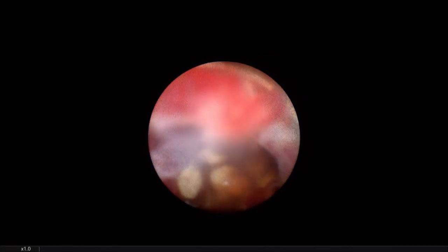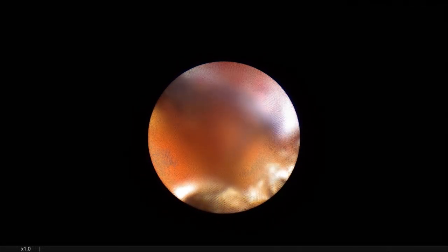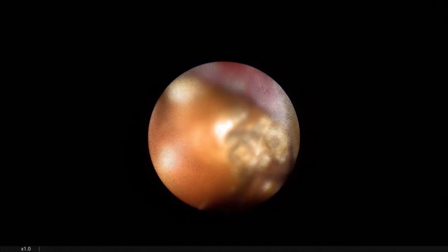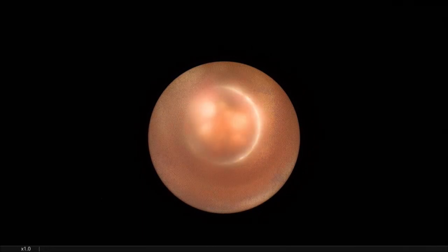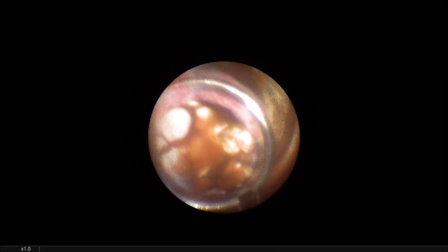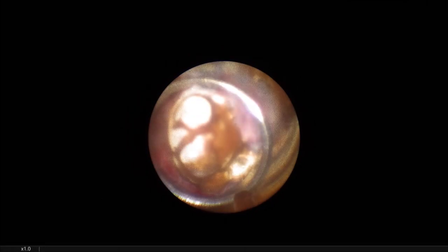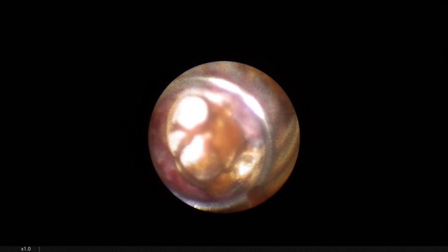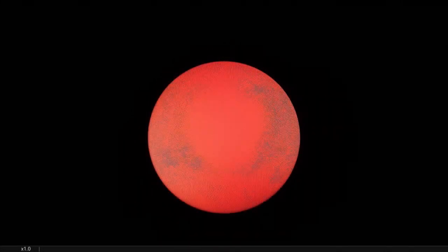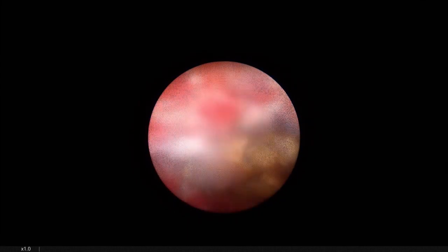This is a calcium oxalate monohydrate stone, which is very hard. And we can go up to 1,500 and 8 hertz. 1,500. This is 1.45 joules. It's okay. The frequency, it's okay. Now we need more hertz. You need more hertz? 8. So we'll have to be on standby and increase. You want 10? 10. Okay.